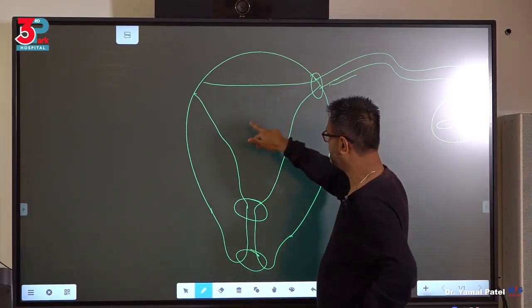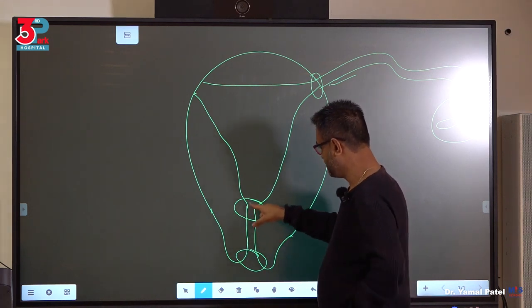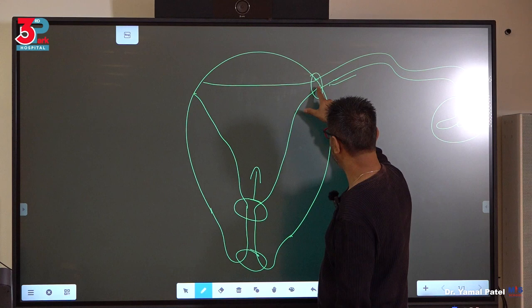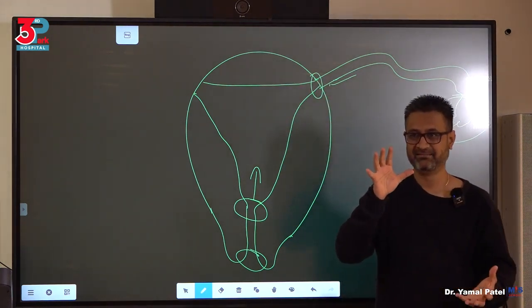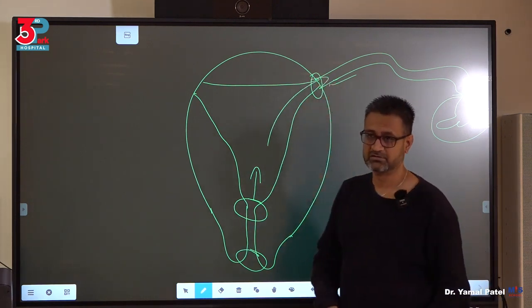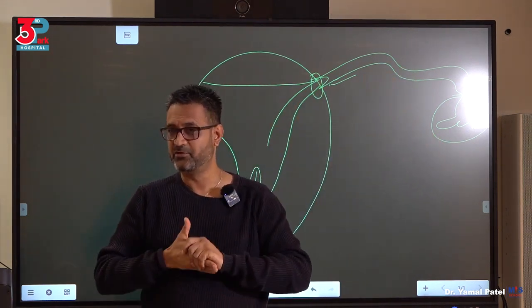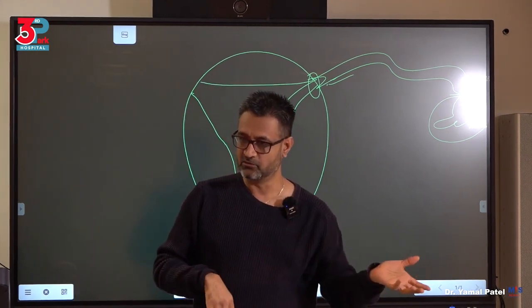When you want to see this cavity properly, you have to have this area passed or gone through, but you have to ensure that this area is preferably not opened up. Are you getting it? Because otherwise, all your fluid will just flow out. So you'll have a lot of fluid intravasation into the abdominal cavity, and you have a higher chance of fluid overload.